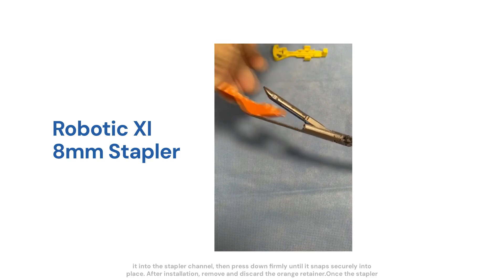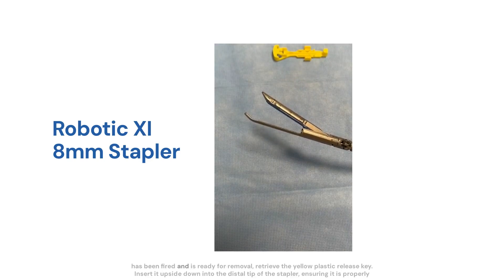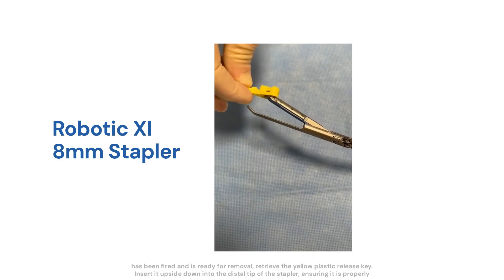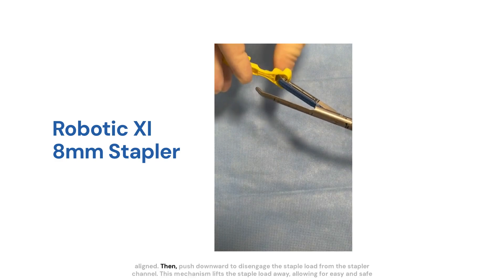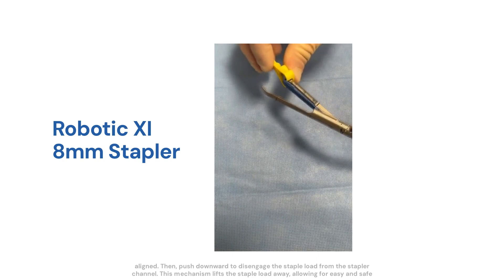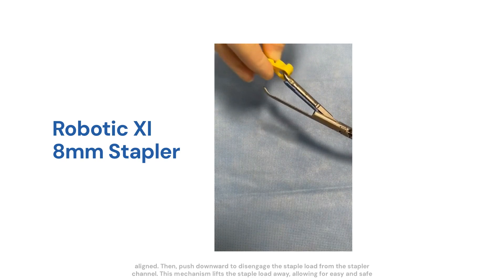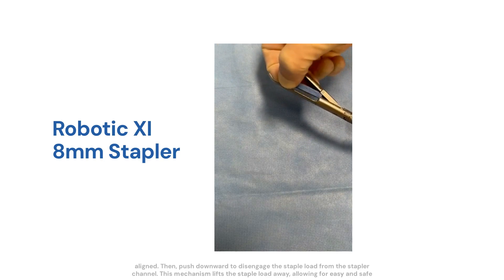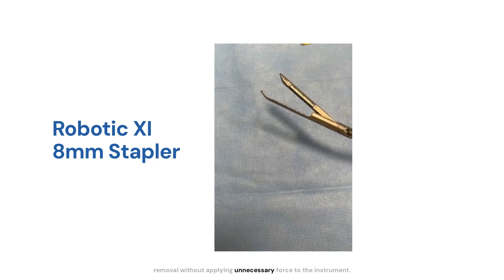Once the stapler has been fired and is ready for removal, retrieve the yellow plastic release key, insert it upside down into the distal tip of the stapler, ensuring it is properly aligned. Then push downward to disengage the staple load from the stapler channel. This mechanism lifts the staple load away, allowing for easy and safe removal without applying unnecessary force to the instrument.